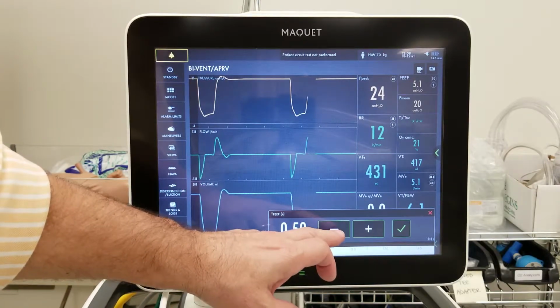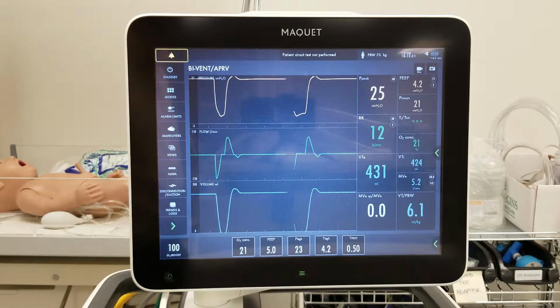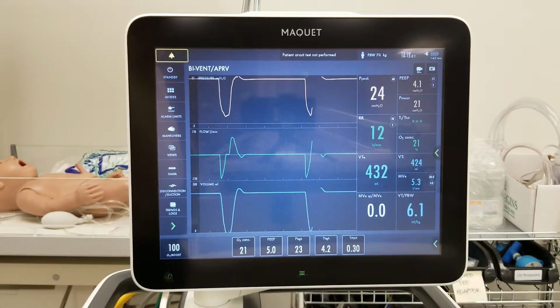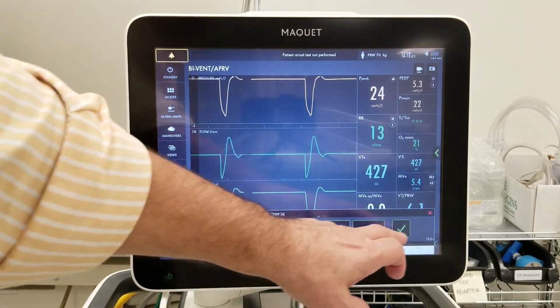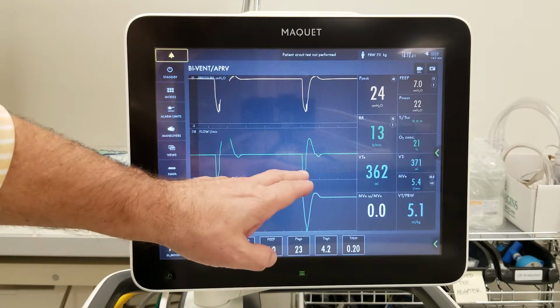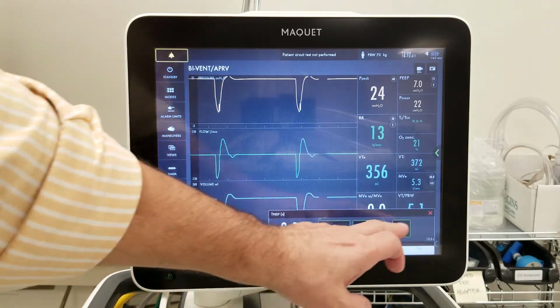I'm going to go down to about 0.5 and see if I think that's still going to be too long. Oh, yeah, it definitely is. Okay, we're starting to get there. You can see we're not returning. We're going to get very short here. There we go. Okay, now just ballparking, that's about right. You can see we've fallen to maybe 70% or something. Let's try one more.